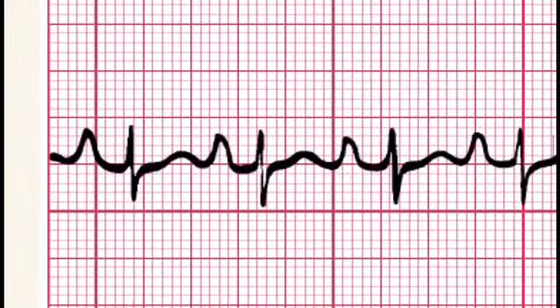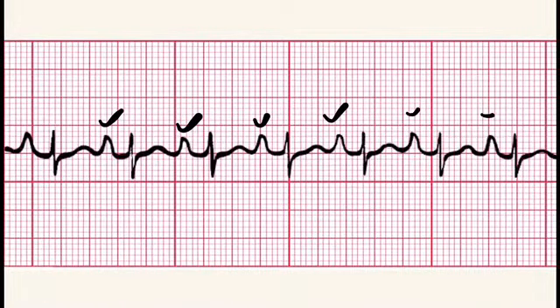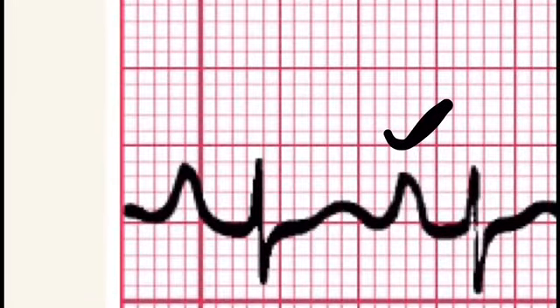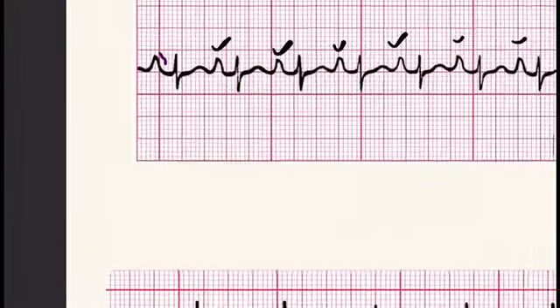Now see this. As you can see, the P wave is more peaked here, okay. Because of this more peaked P wave, the left atrial wave, which is normal, is hidden inside it, okay. So there is a very minor change in this curvature, and that is where the left atrial wave is hidden, okay. So the main change that you will see in right atrial enlargement is the peak of the P wave, okay.